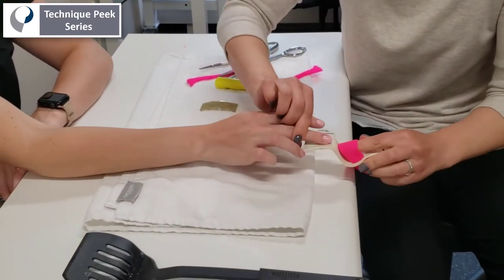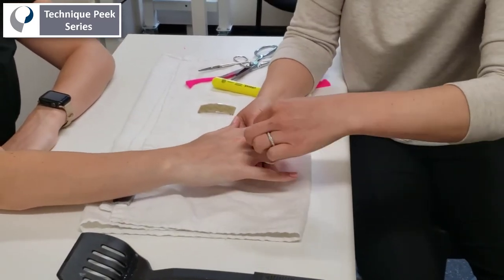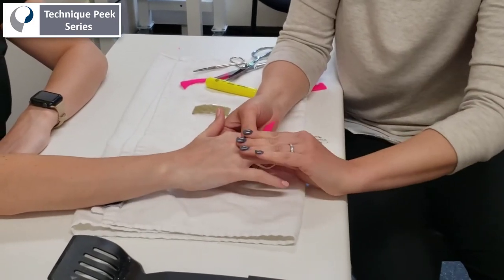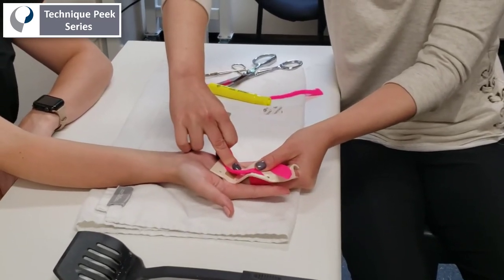Then you'll slide the patient's finger in so that the PIP joint is lined up with that strap, and beneath the contracted PIP joint is that bubble into which the joint will stretch. Have the patient turn their palm up and they can tighten that loose strap until they feel a mild to moderate stretch sensation.